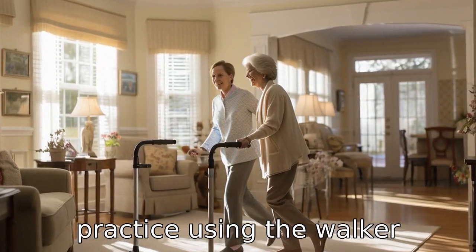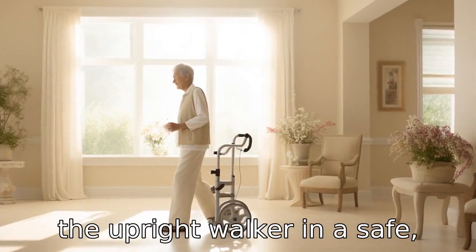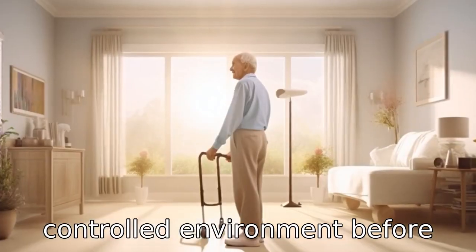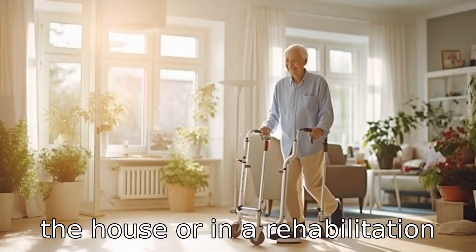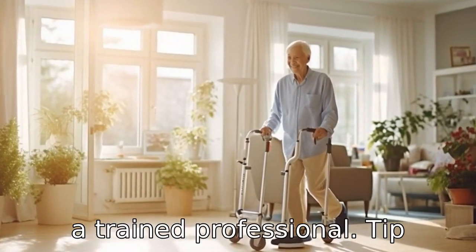Tip 2: Practice using the walker. Seniors should practice using the upright walker in a safe, controlled environment before using it in everyday situations. This could be around the house or in a rehabilitation center under the supervision of a trained professional.